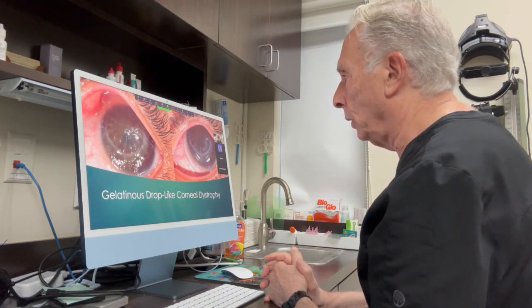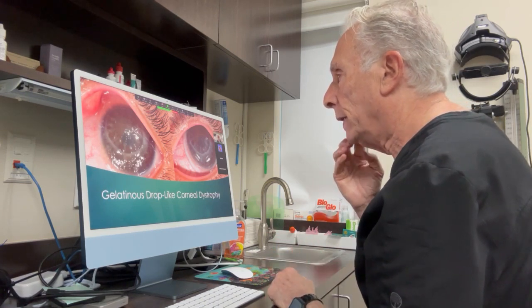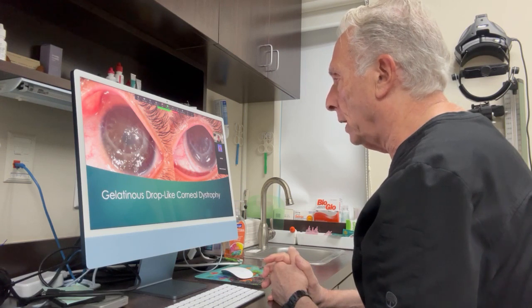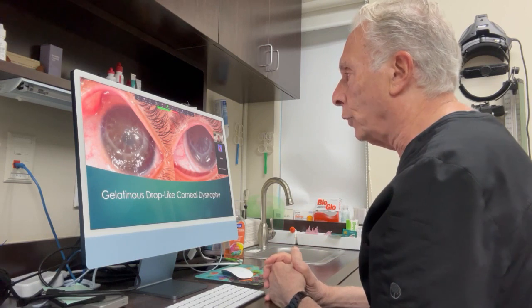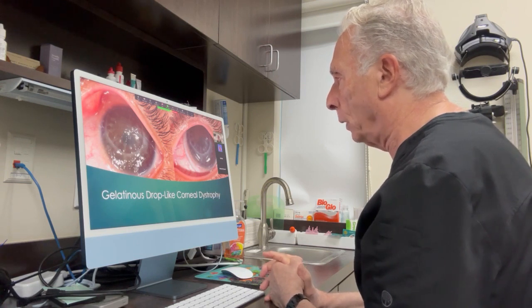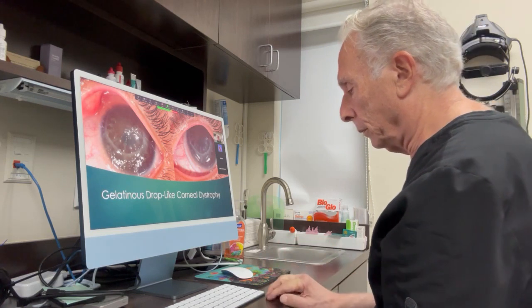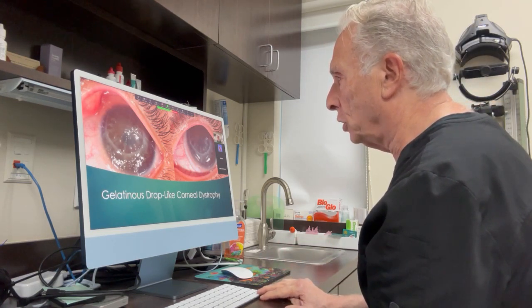Without the lens, the patient's visual acuity is less than 20/1000. With the scleral lens and eyeglasses over, the patient's able to identify around 20/70 vision. His corneal surgeon says he's on a waiting list for another transplant in about a year. So this is where a scleral lens can actually change your life and save a life.